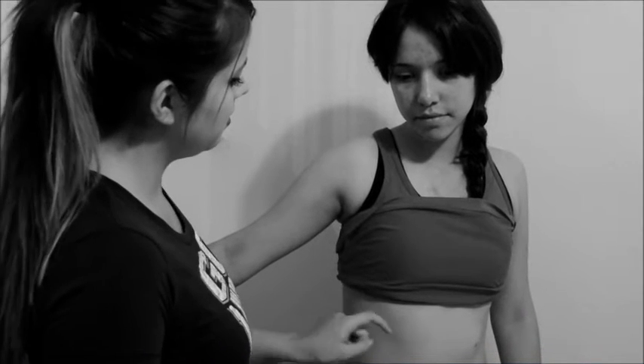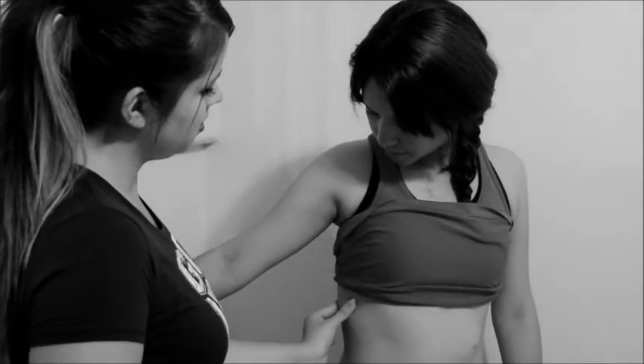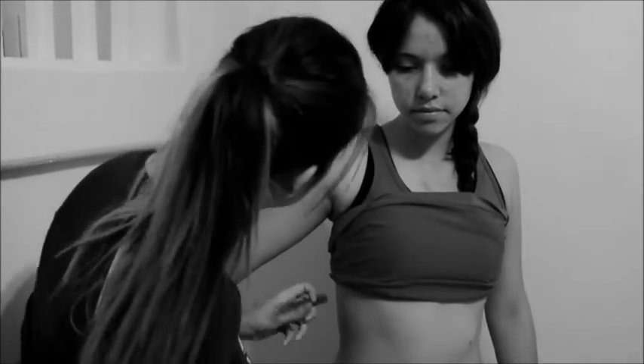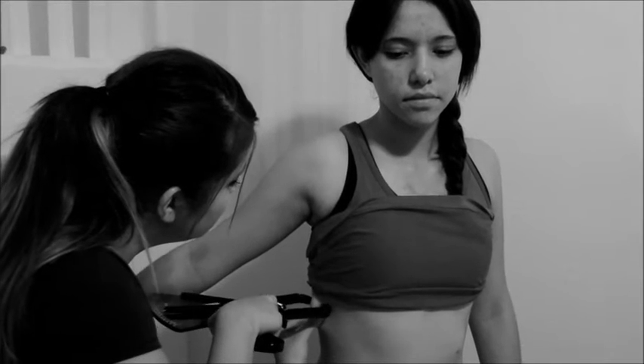Mid-axillary: vertical fold on the mid-axillary line at the level of the xiphoid process of the sternum. An alternate method is a horizontal fold taken at the level of the xiphoid sternal border in the mid-axillary line.